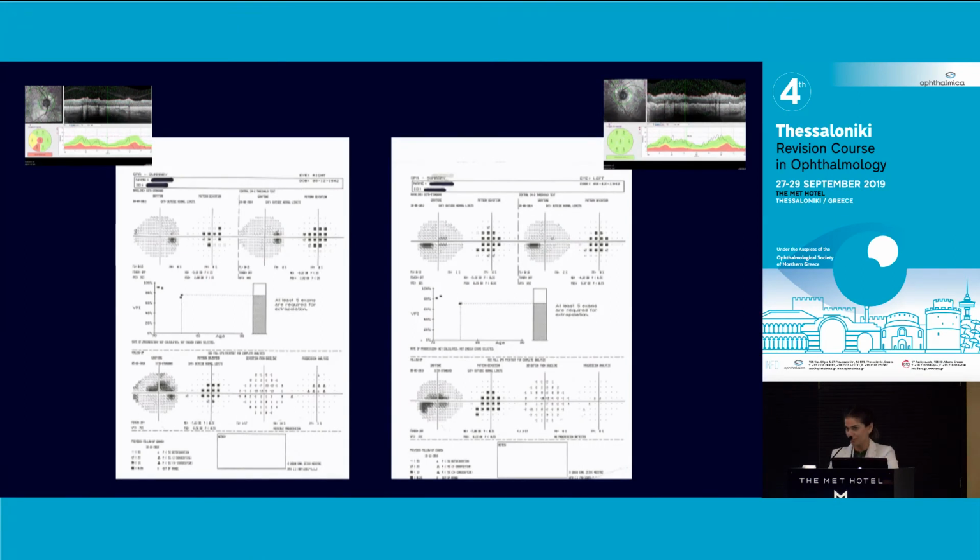If they don't, you're not going to get this clear-cut visual field defect because your middle line will be here. So basically, that could be a visual field test not done properly because the patient is not fixating at the right spot.